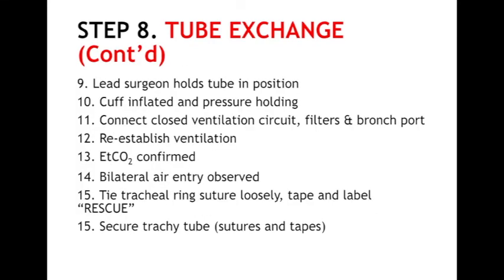Tube exchange is completed with holding the tube in position while the cuff is inflated and it is confirmed that the pressure is holding. The ventilation circuit is reconnected and ventilation re-established. End-tidal CO2 confirms successful ventilation with observation of bilateral air entry without surgical emphysema.